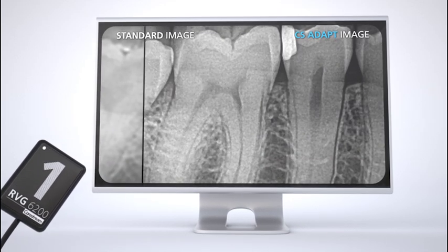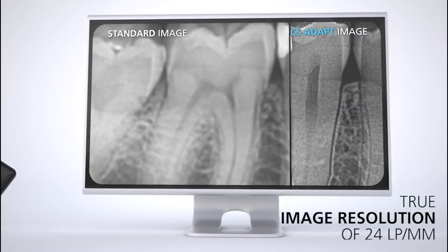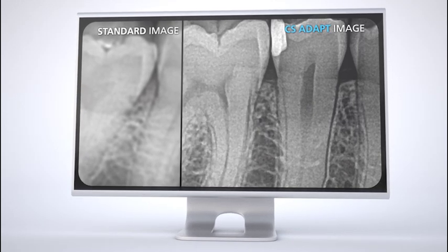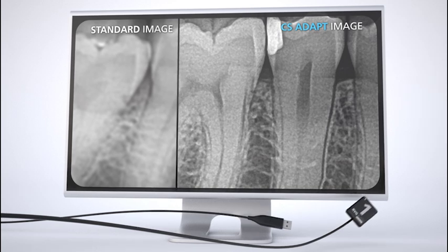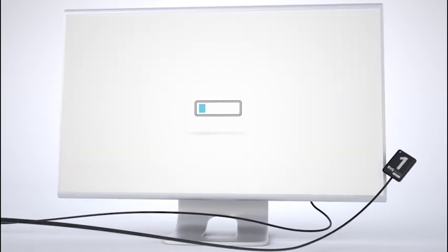A true image resolution of 24 line pairs per millimeter, paired with the quality tools of CS Adapt, gives you everything you need to make a quick and accurate diagnosis. Plus, the intuitive software interface can be easily installed and integrated into your practice.